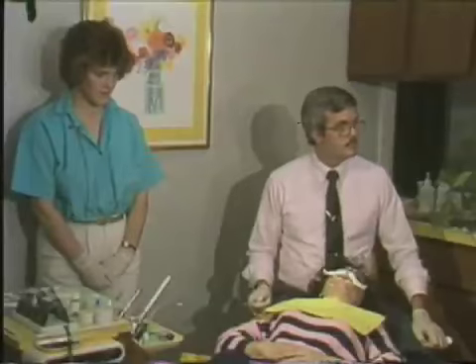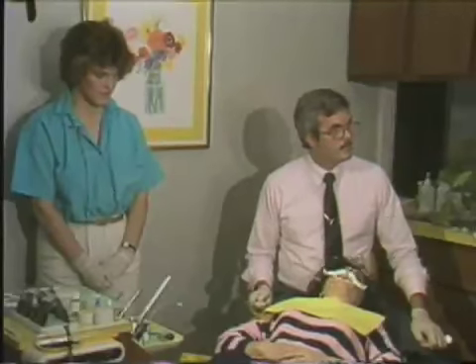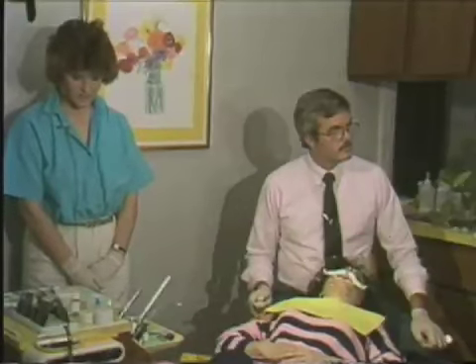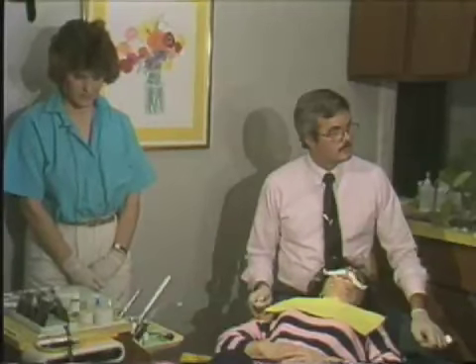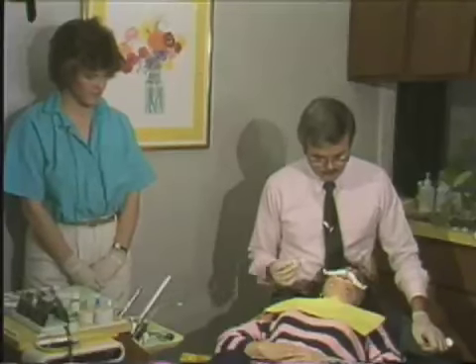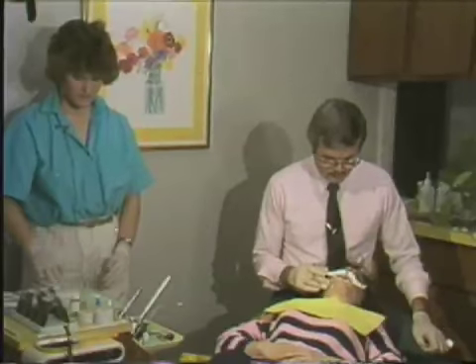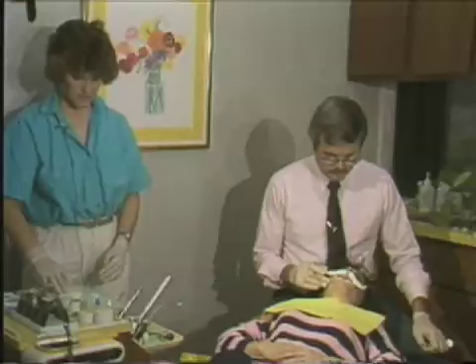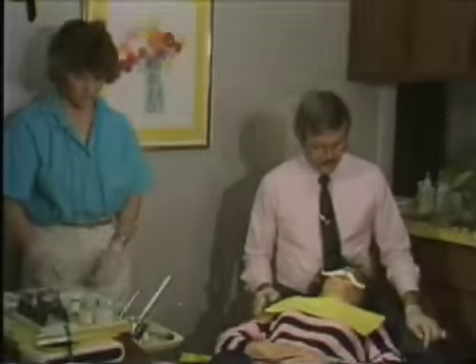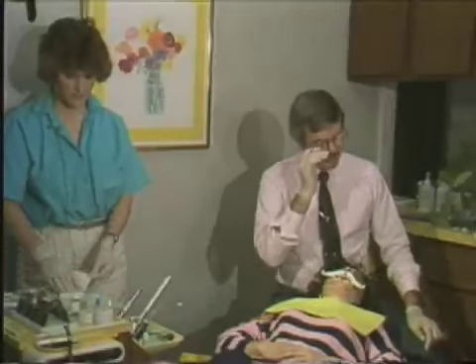I think it's critical to note here at this point also that the working time, once the pastes are mixed, is 2 minutes. And during that 2-minute working time is when the excess adhesive flash also should be cleaned off. Because once that hardens, unlike the no-mix, it really cannot be removed unless it's removed with a disc or a burr. Now we've just completed bonding, let's say, 6 brackets.